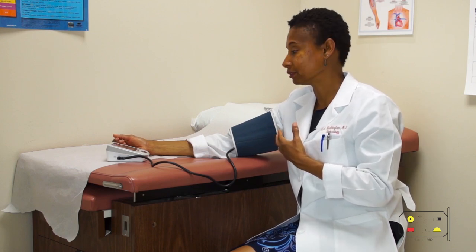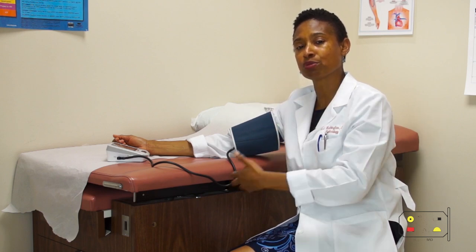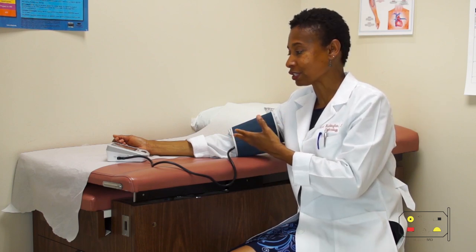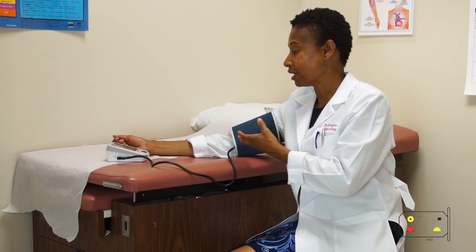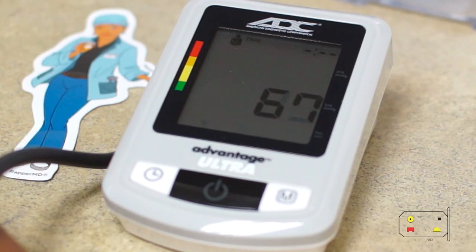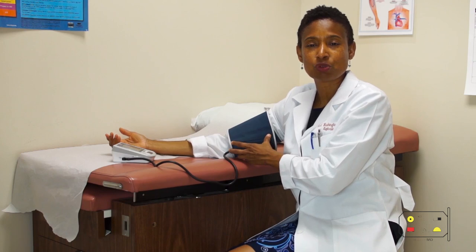So it's collapsing my artery. And now it's measuring that pressure. The moment that artery opens up, that's the pressure that my heart will push blood all the way through to my entire body. You hear the beeping noise. That's also taking my pulse. You see what your heart rate is doing. And this will continue to deflate until the artery is completely open and blood passes through with no resistance. That's called your diastolic. Actually, you want your top number to be less than 120 and your bottom number to be less than 80.